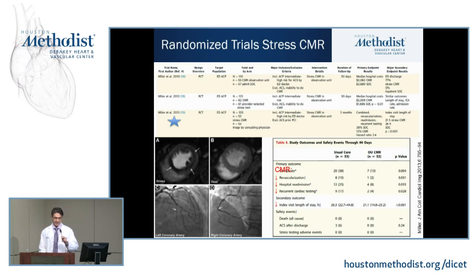Okay, so stress-only imaging, again, has the value that we discussed. Before I get to the calcium scoring, I wanted to mention MRI. There have been 3 studies of MRI in the emergency department setting that all have shown this is a very viable technique as well, without any difference in MACE compared to a conventional group or usual care in follow-up. So this is also a technique that can be done and has been studied.